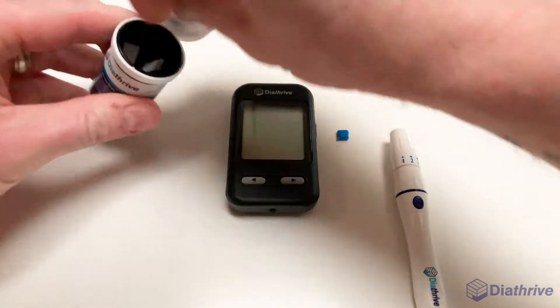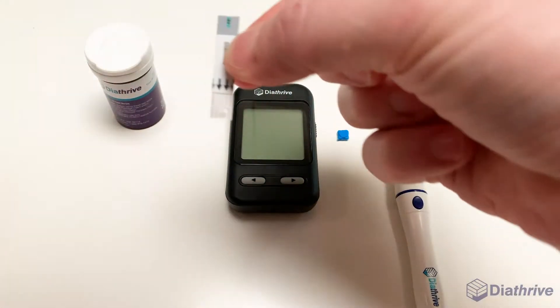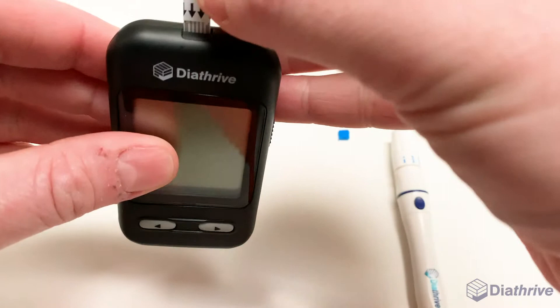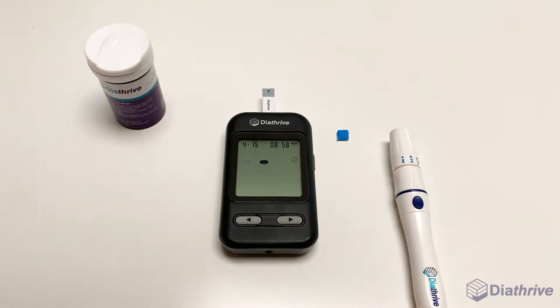Step 3: Insert a test strip into your meter. Position your test strip so the arrows point down. On the top of your meter, you will see where the strip should be inserted. Your meter will automatically turn on. Wait for the strip and blood drop icon to begin flashing before applying blood.